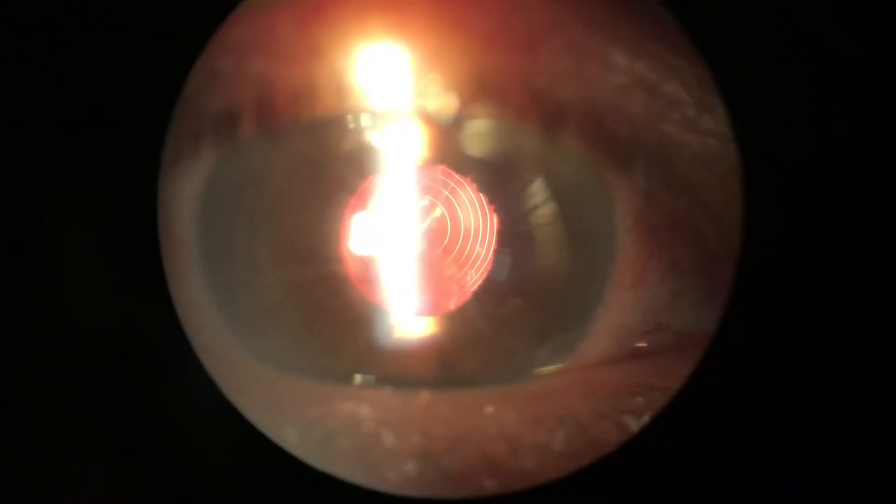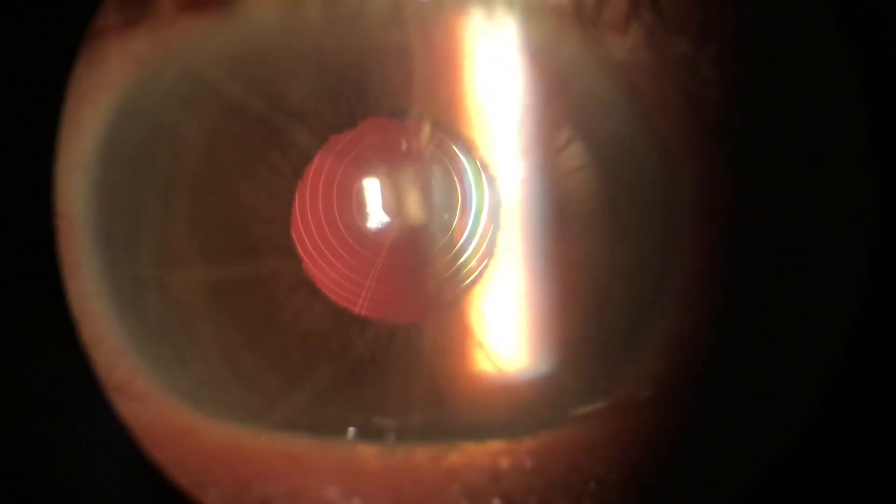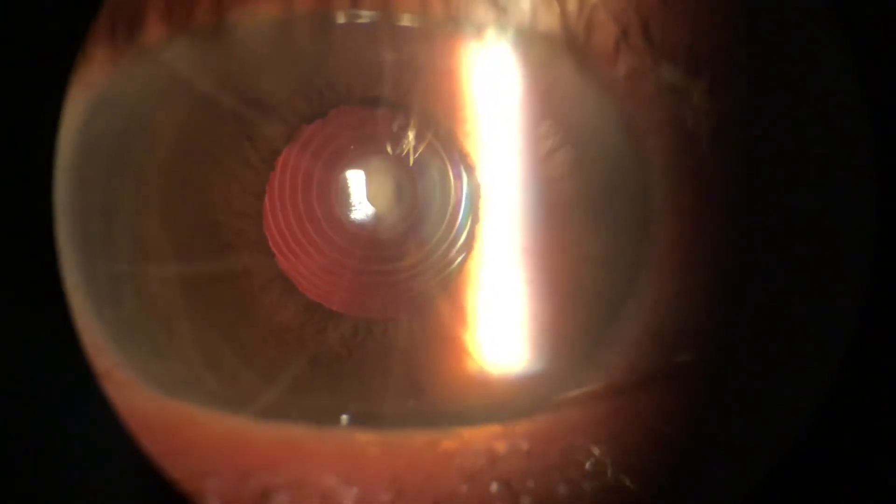This is the patient on the first day postoperatively. We can see through the slit lamp that the lens implant is perfectly centered. The patient's vision was 20/25 uncorrected, and the patient was very pleased with their unaided and best corrected visual acuity.